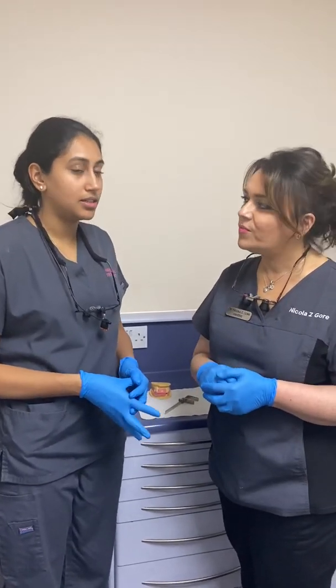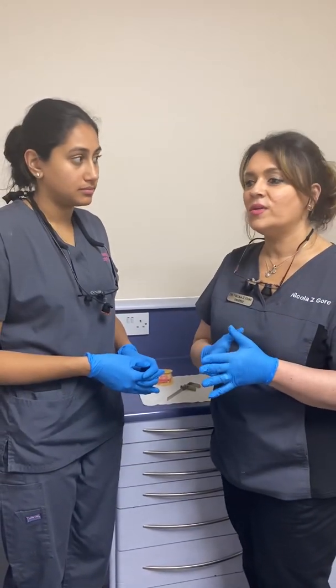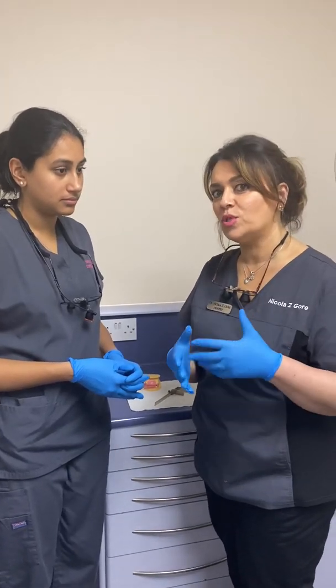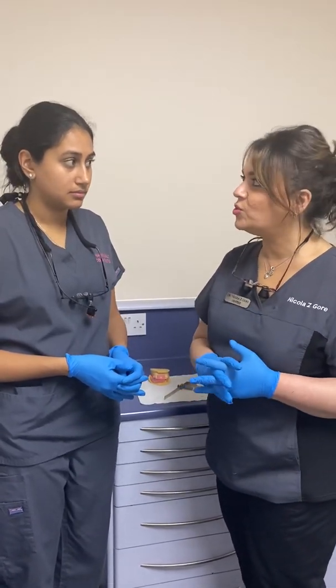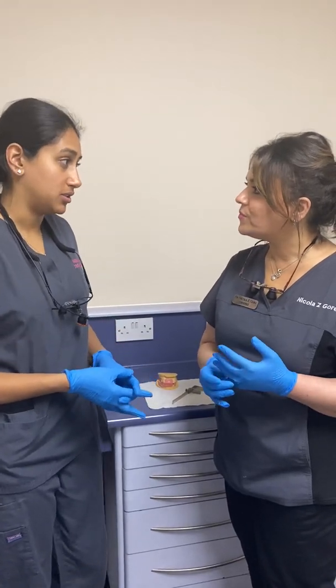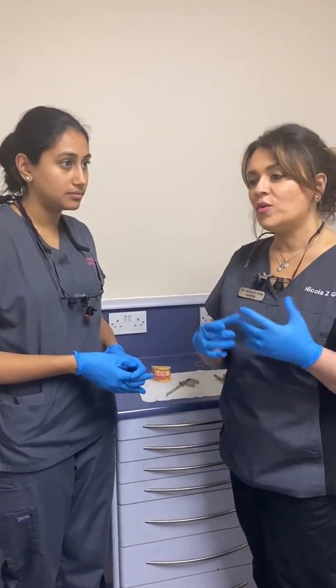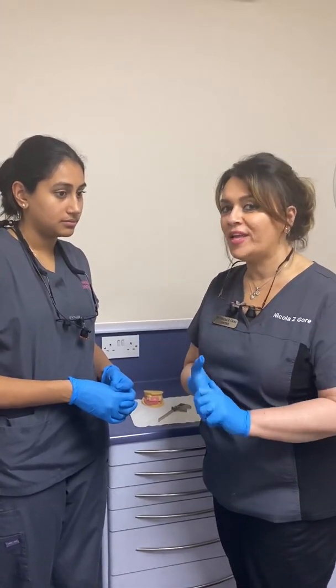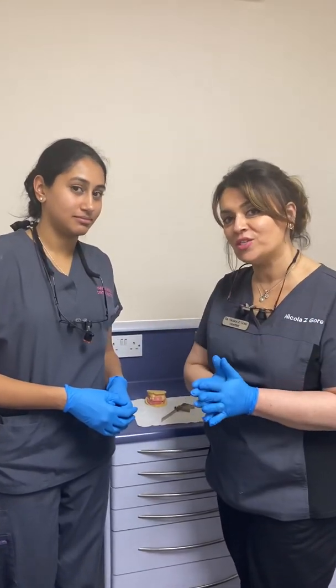For primary impressions, we use alginate in our practice because it gets poured up on the same day, so it will be dimensionally stable. If alginate is poured up straight away, it is stable. If your lab is not going to pick up on the same day, then they could use zinc oxide eugenol or silicones. You can also use composition if you have it in your practice, and you can alter your denture tray with green stick — we can show you how to do that in another video.